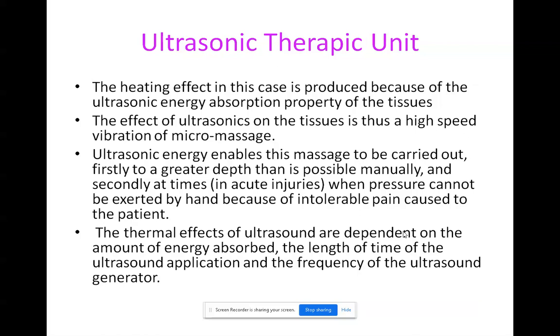So here the heat is going to be produced due to the ultrasonic energy. Okay, so the heating effect in this case is produced because of the ultrasonic energy absorption property of the tissue. So your body tissue is going to absorb the ultrasonic energy.